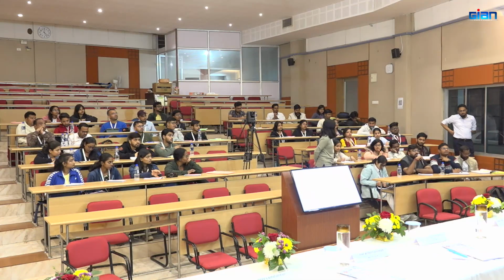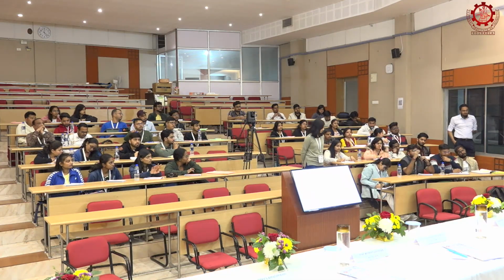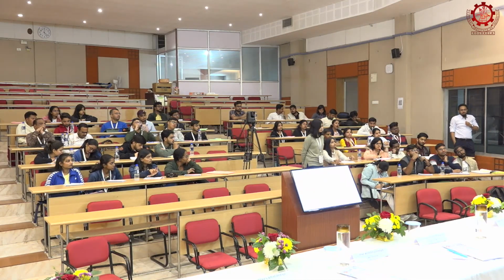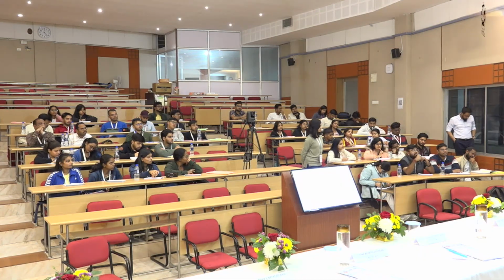So what's the fundamental strategy that goes into, let's say, training of a vision language model? If we are using any kind of image to train the model, then after that training, one model can give some image related features, some feature points, and some text related points.